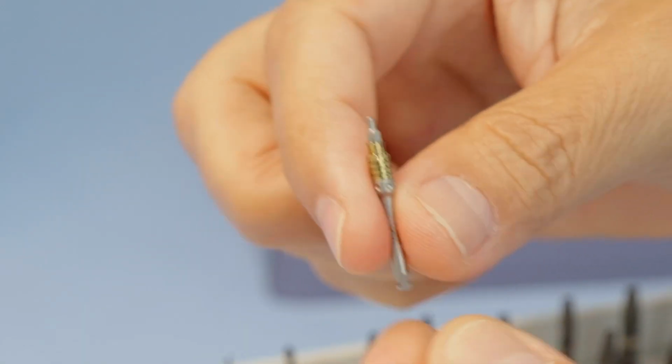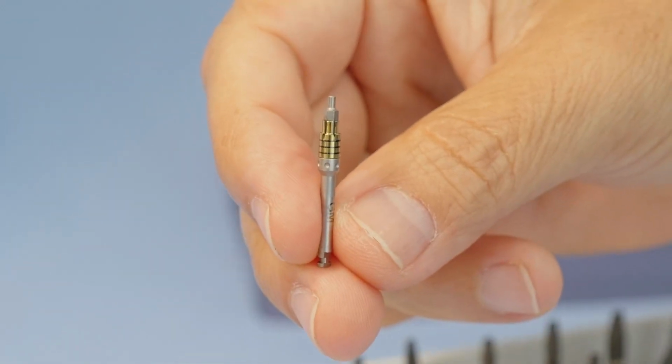Once you have completed your sequential drilling and you're ready to now place your implant, there's two ways that you can do this. Either you're going to drill it in with your motor, and normally that's the way that I like starting. I just use my motor, I put it at maybe 30 to 40 RPM, I increase the torque maybe to 30 to 35, and then I just start drilling the implant into the implant site. And I'm obviously going to use the carrier, a latch type of carrier that you connect to your implant.